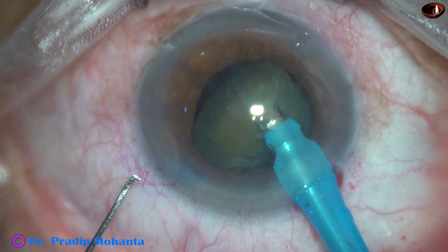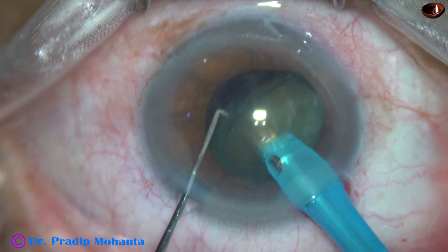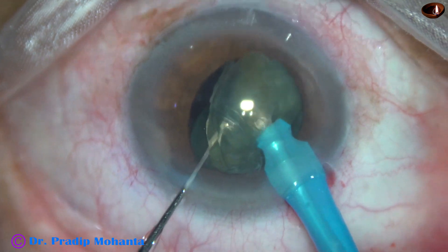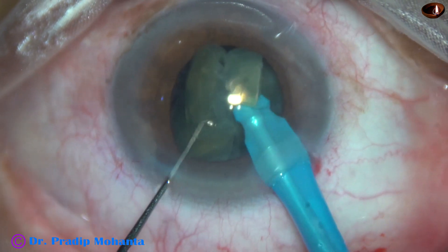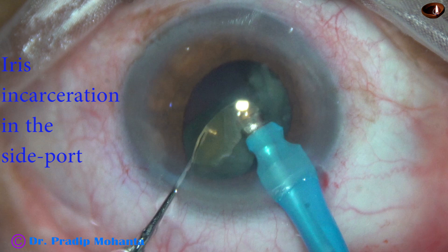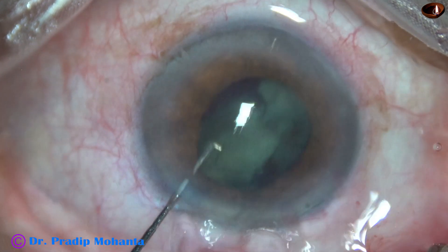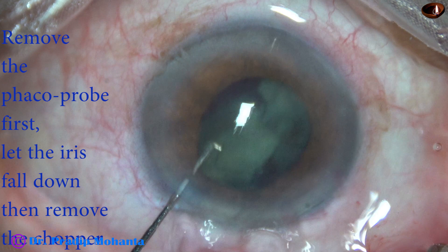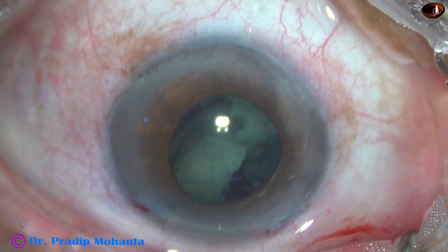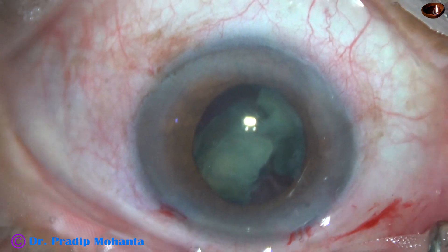I find that this is a large piece, so I hold it and go in again. As I do that, I find that the iris has incarcerated into the side port. Whenever it happens, we should not come out immediately. We can come out after removing the phaco probe first — as we remove the phaco probe, the iris will fall back and we can then remove the chopper. If we don't do this, we will cause iris stromal injury with the chopper.